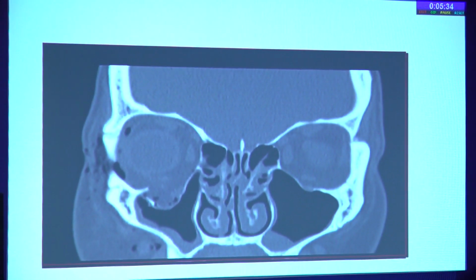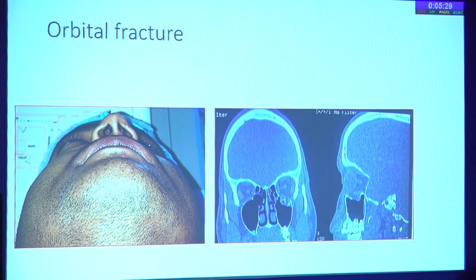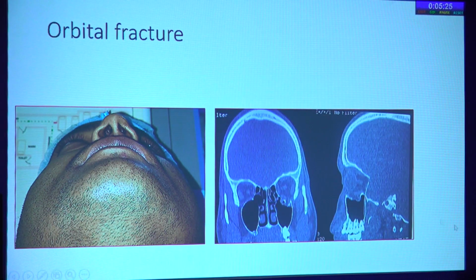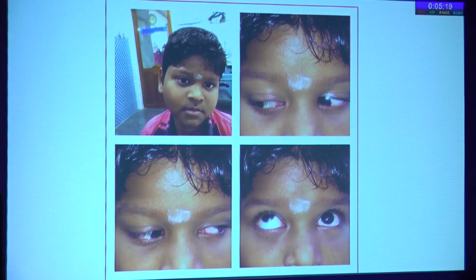treatment. We have been successfully managing orbital fractures for many decades with the many types of implants available in the market. As in this patient, where both anterior and posterior ledge are seen, we can very comfortably go ahead with surgery with a Medpor implant.